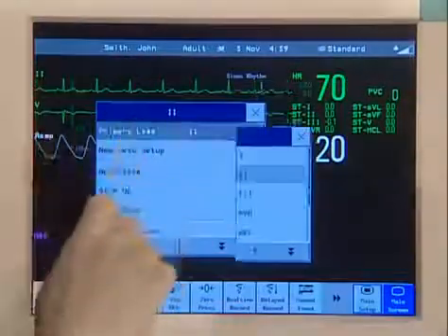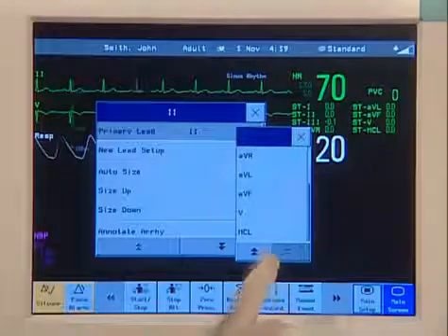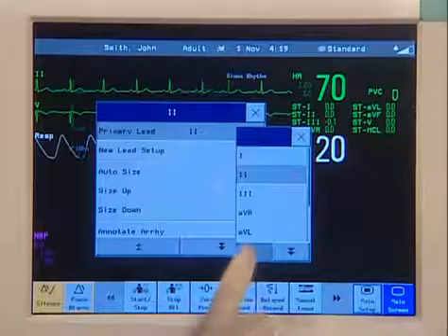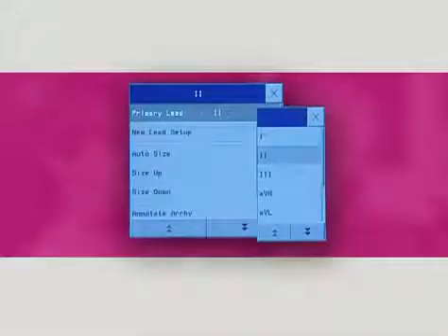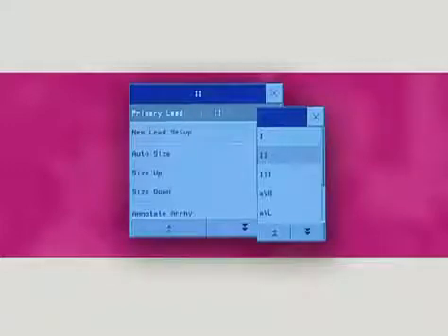You can change the lead to any of the available leads depending on the lead set you're using. The monitor uses the primary lead and, if configured to multi-lead, the secondary lead to compute heart rate and to analyze and detect cardiac arrhythmias, so it's important that the primary lead provides a good signal.